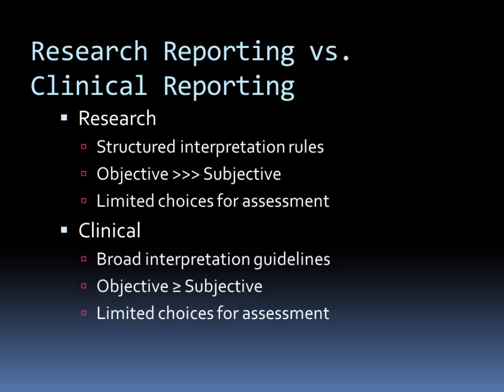And so over the years, I've developed an interest and have placed a lot of emphasis on reporting practices. At the beginning, I'll differentiate between reporting for research and reporting for clinical ends. Research reporting is generally very structured. You set the rules ahead of time by which the scans are going to be interpreted, and then you interpret those scans according to what those rules are. So it's a very rigid format. In clinical reporting, we have much more freedom to convey what's going on with the patients, to use our expertise to help the clinicians arrive at the best course of management. We have relatively broad interpretation guidelines, and it emphasizes objective measures more than subjective.